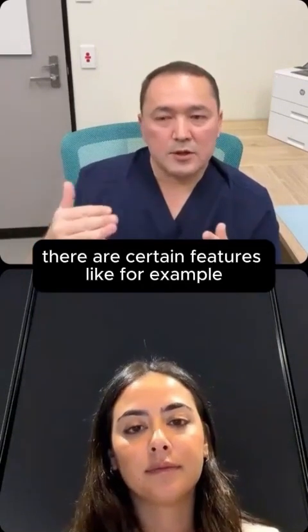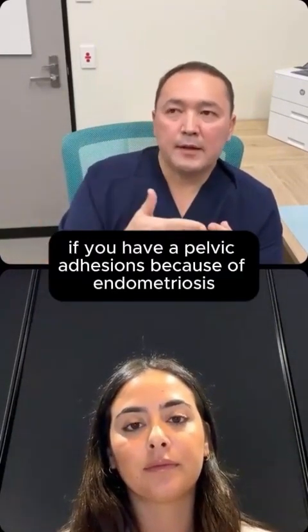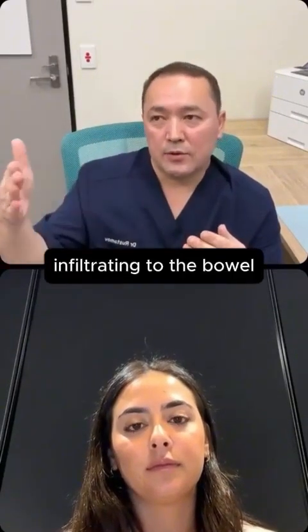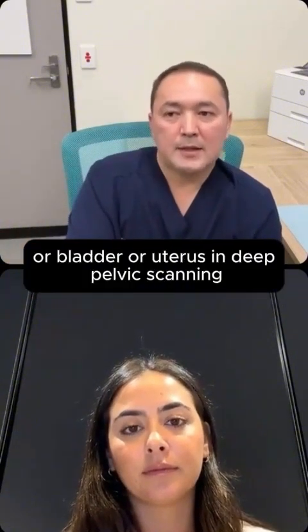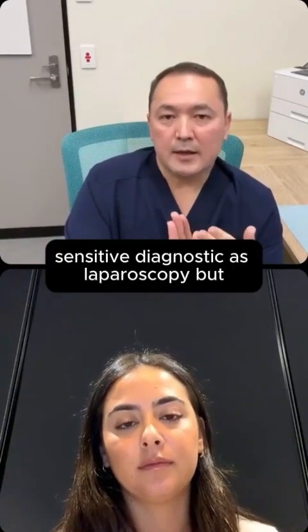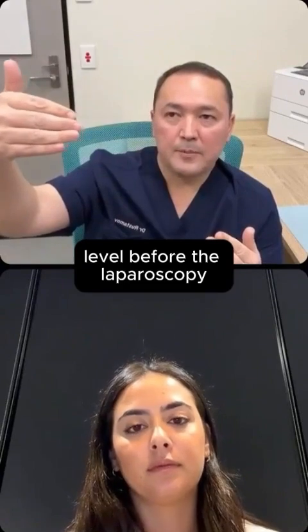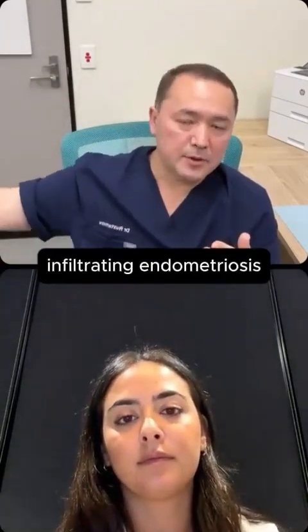There are certain features, for example, pelvic adhesions because of endometriosis, or endometriotic nodules infiltrating the bowel or bladder or uterus, that you can detect in deep pelvic scanning. It's not as sensitive a diagnostic as laparoscopy, but as a step before doing laparoscopy, you can do deep pelvic scanning to rule out deep infiltrating endometriosis.